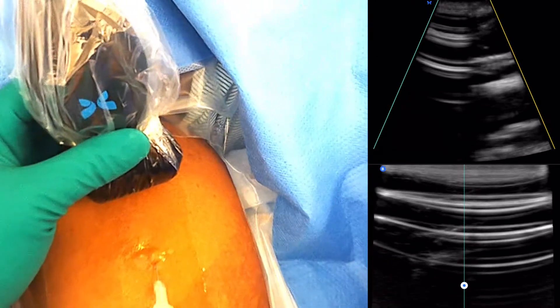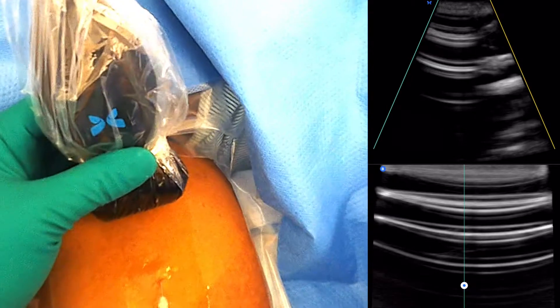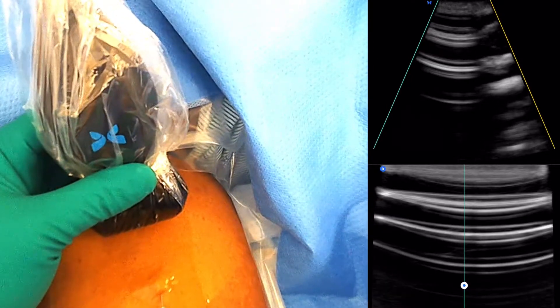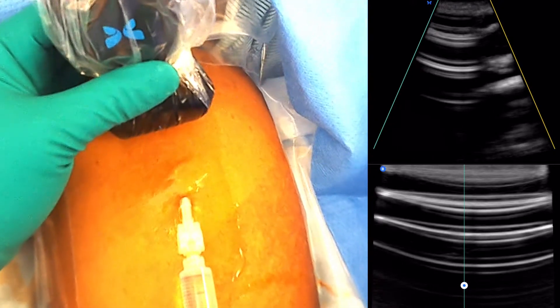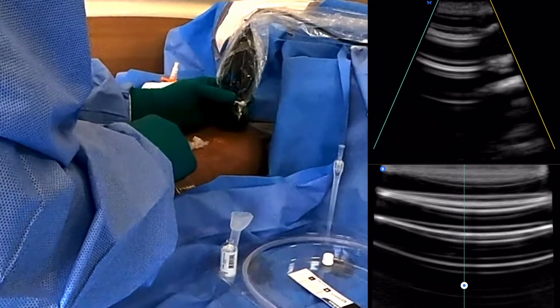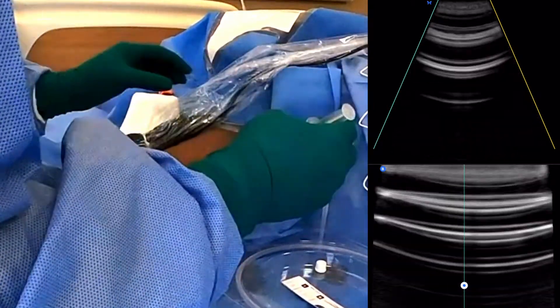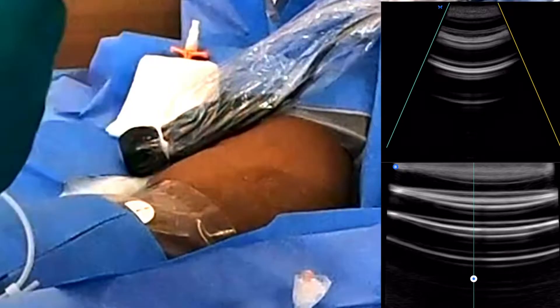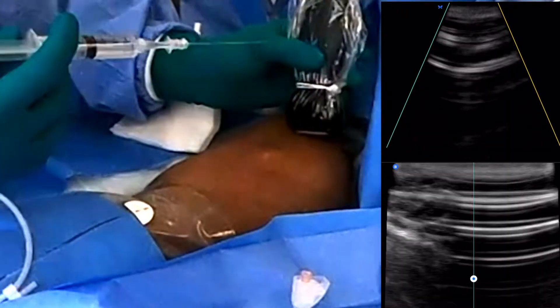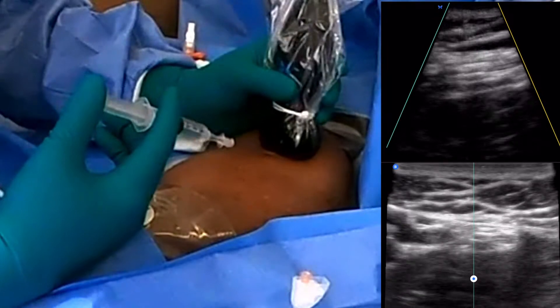Any kind of burning? Very comfortable. You guys can see that intradermal wheal developing and spreading as I inject — you can tell I'm going slow, a lot slower than most of you probably do. I like to cover that entire area because I want to make sure it doesn't feel the dilator. Now the lidocaine is saved up — we're going to do needle tracking and numb as we go. This is the numb-as-you-go technique, taught to me by Matt Gibson.